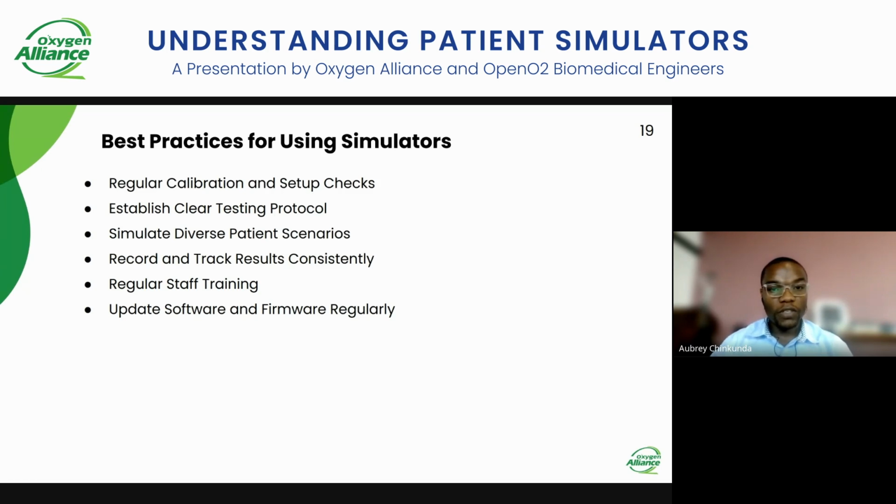Make sure you train the staff regularly to ensure that everyone is up to date. Make sure you also update the software and the firmware inside the device. You always want to have the most updated software, because the new versions always come with better and improved features. So these are some of the best practices that we can follow when you're using patient simulators. This is the end for my part. I'll hand it over back to the host before we get into the live demo.